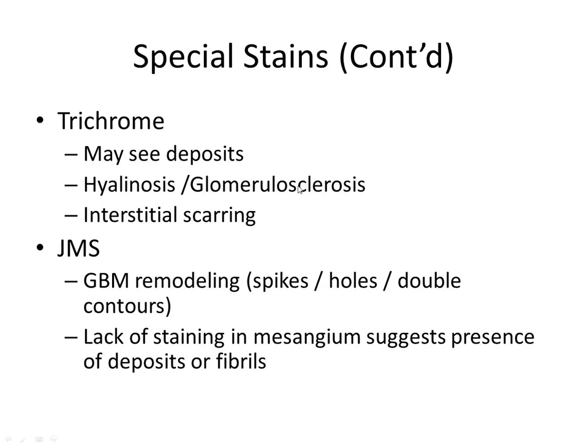Again, the hyalinosis and glomerular sclerosis can be highlighted with the trichrome stain. And then also the best thing for the trichrome stain is really to look at that interstitial scarring. Sometimes when you have tubular interstitial disease, it'll actually just be edema. So when you're looking at the trichrome stain, you see separation of tubules, and it's kind of a light blue matrix. And you don't want to overinterpret that as being collagen. You want to characterize that as edema, because the edema can go away. But if it's dense blue, it's going to be collagen, and that is irreversible change. So again, kind of characterizing what's going on in the interstitium. Is it more edema or is it more collagen deposition?